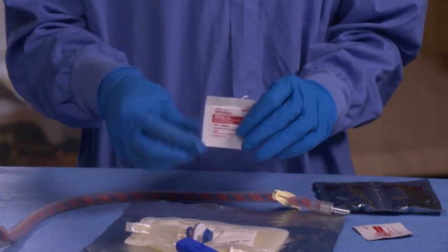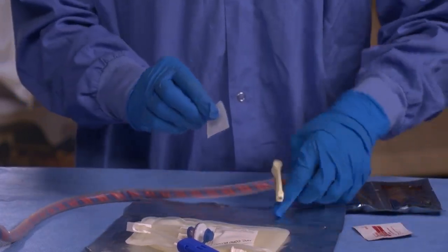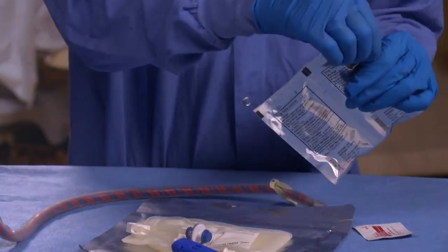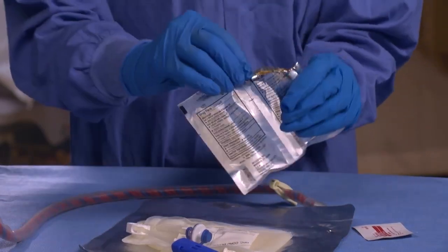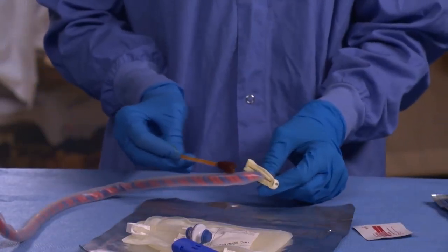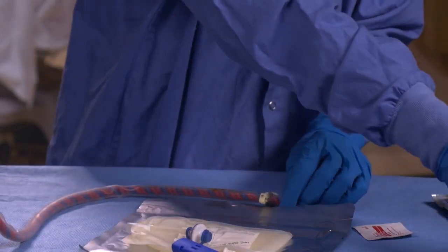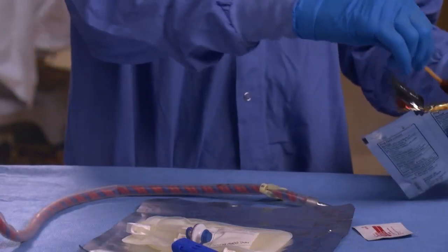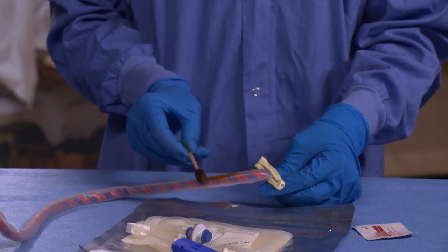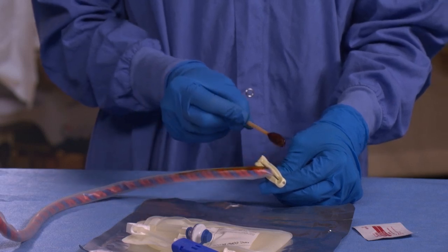It is important to sterilize the collection site, so use rubbing alcohol before you begin. Then wipe the same site with one povidone iodine swab for 15 seconds and discard it once finished. Using a second iodine swab, start in the middle of the collection site and move the swab upward one inch, then rotate 180 degrees and move the swab down an inch. Discard the used swab once done.